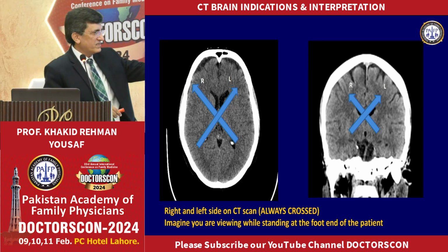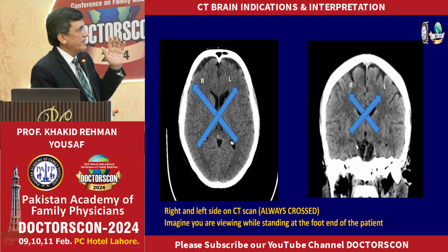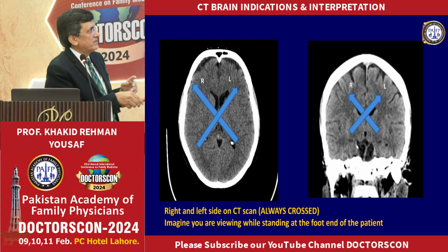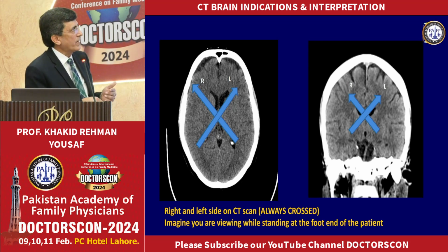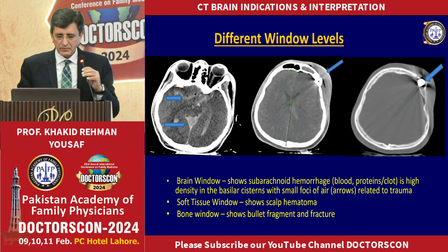Patient का पाँव इधर है, सर उधर है, उधर से आप खड़े देख रहे हैं. So the image on your left is the right side of the patient, and on your right is the left side of the patient. This is the axial section, and this is the coronal section. This is how you look at the right side and the left side. There should be a clear concept about this.